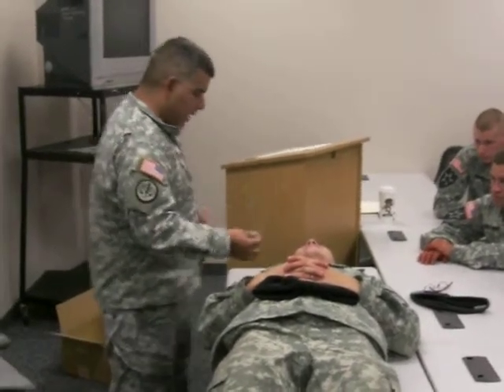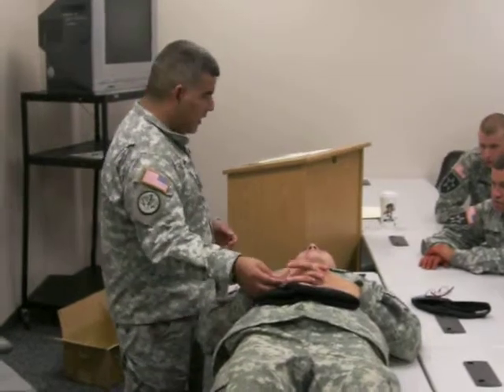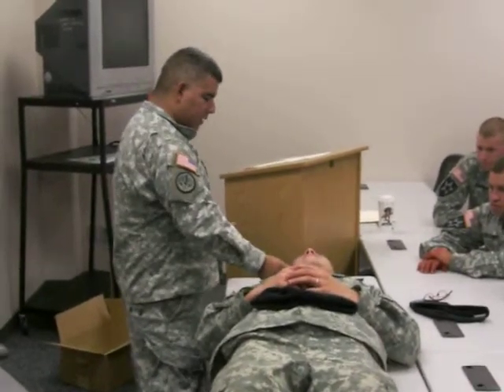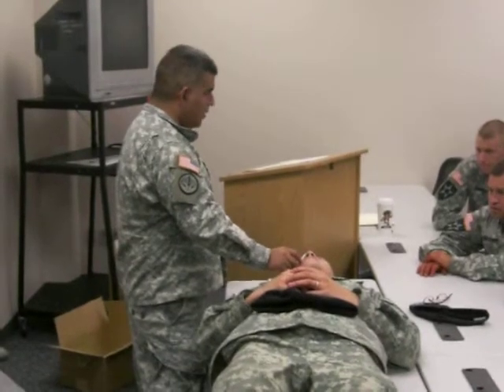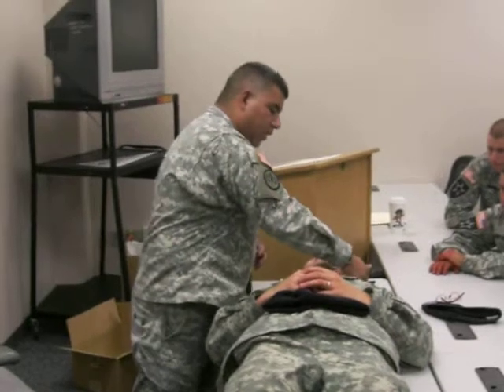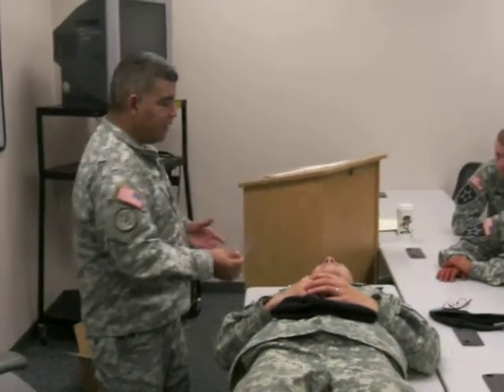First thing we want to do is size it up. And we size it up to his pinky. Next thing we want to do is size it up to the patient itself, from the tip of the earlobe to the tip of the nose. What that does is give us our airway length, because it actually goes from the front all the way back into the back of the throat. So that gives us our length.